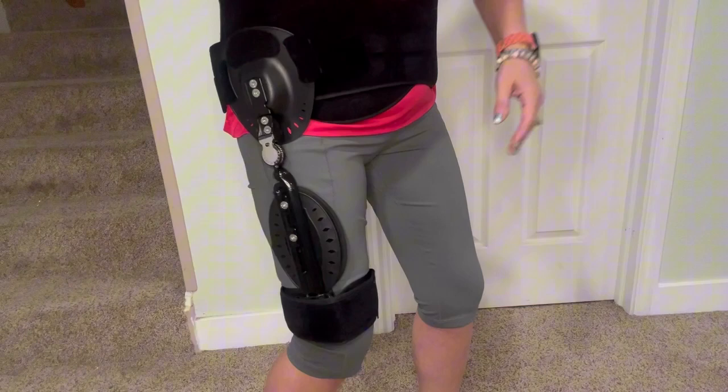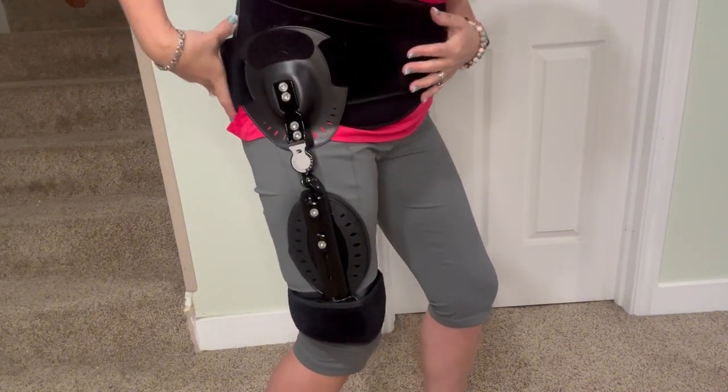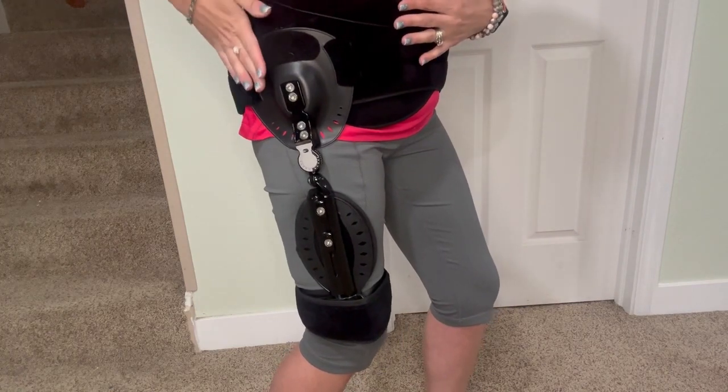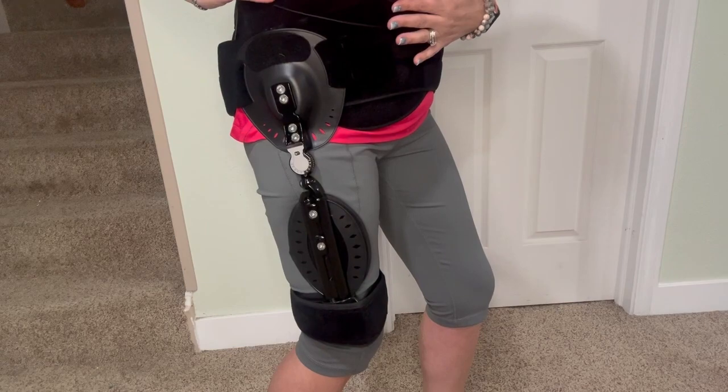There is a pull string so you can pull the waistband even tighter for further flexibility. It also has a very strong velcro on it so that you make sure this is exactly how it should be on your body and you are wearing it correctly.